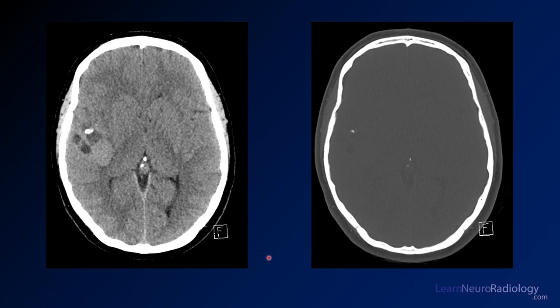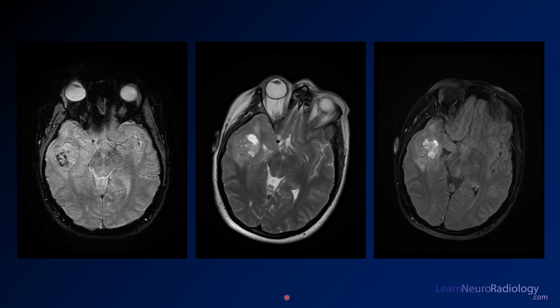On the CT brain window, you've got a cystic lesion in the right temporal lobe with a little bit of calcification. The bone window confirms that's probably calcification, and there's a little bit of mass effect. On the susceptibility-weighted imaging or GRE, we see some low-intensity signal — in this case it's probably calcification rather than blood products, though there may be a little bit of blood as well.